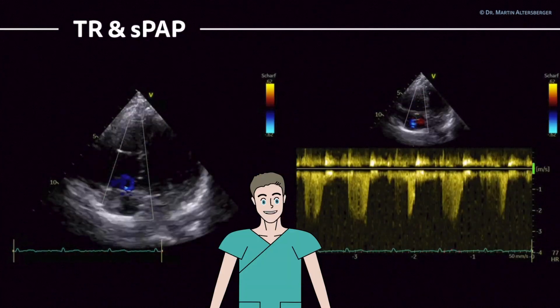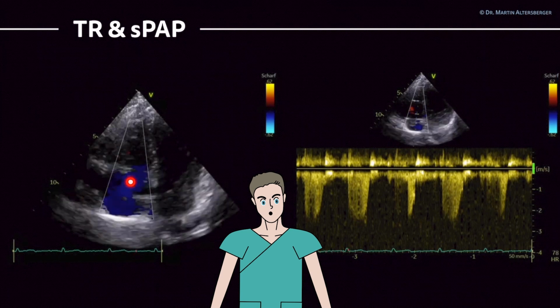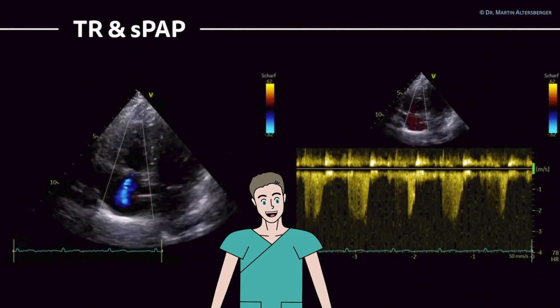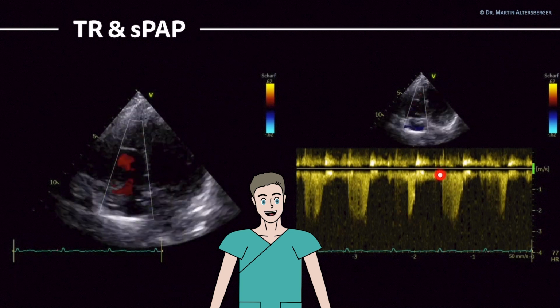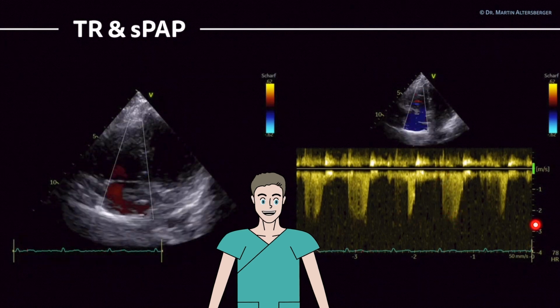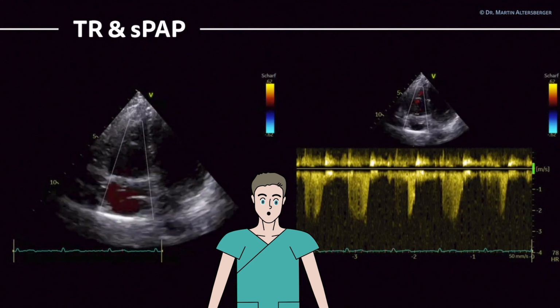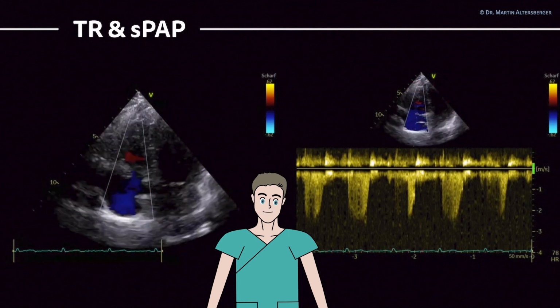In this case, we have the tricuspid regurgitation. We see it's over here, it's physiologic, so it's mild. And with the continuous wave Doppler, we get this nice signal where we can actually measure the TR velocity. This is an optimized view, on purpose with some foreshortening present.